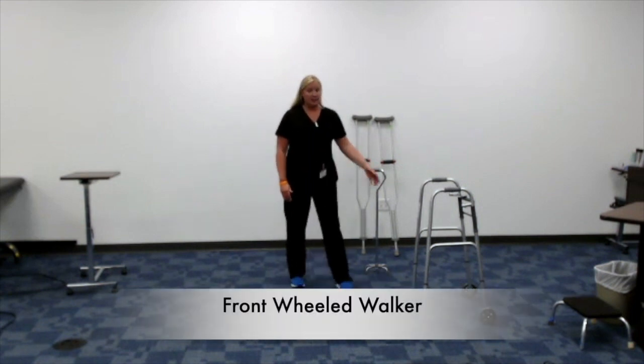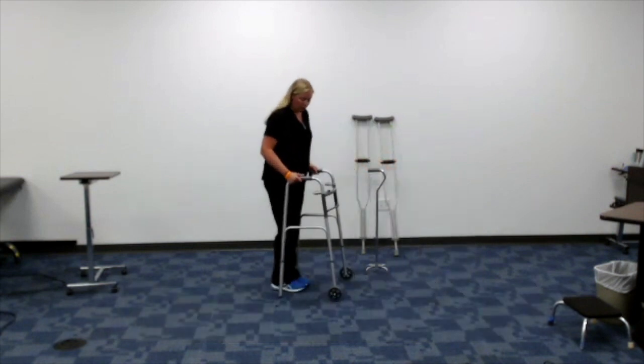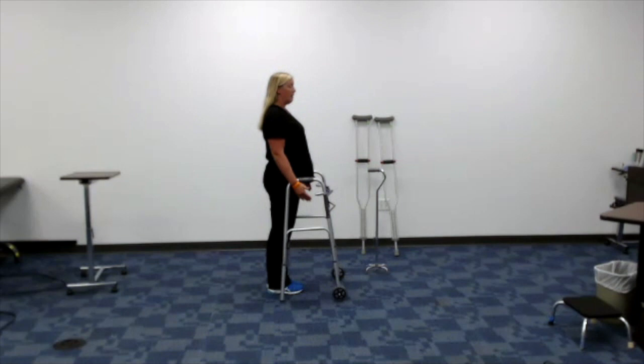For a common device such as our front-wheeled walker, I am able to position the walker with the posterior leg of the walker at my midfoot. From there, I'm going to assume my normal posture. And I want to be able to look for 3 landmarks. The first is going to be on the lateral portion of my leg. It's a bony landmark that I can feel or palpate, and it's called the greater trochanter. It's an attachment site for muscles. And so I want to have my walker aligned with the greater trochanter.